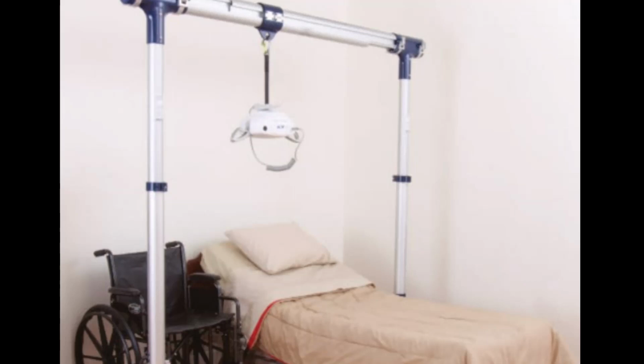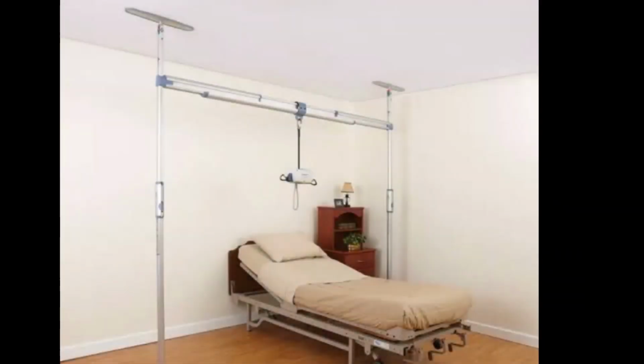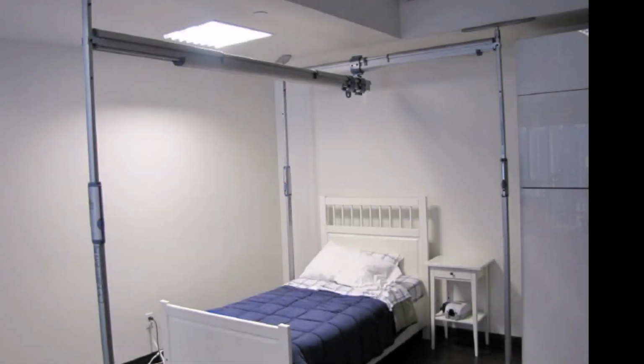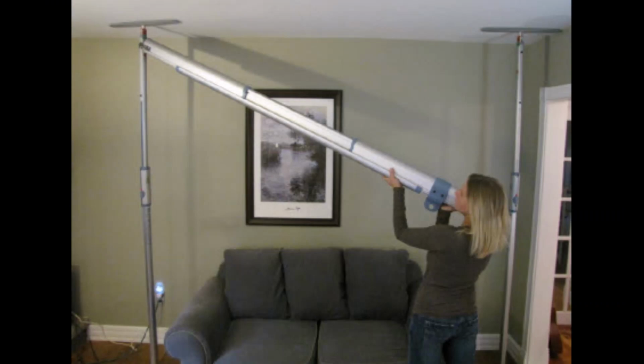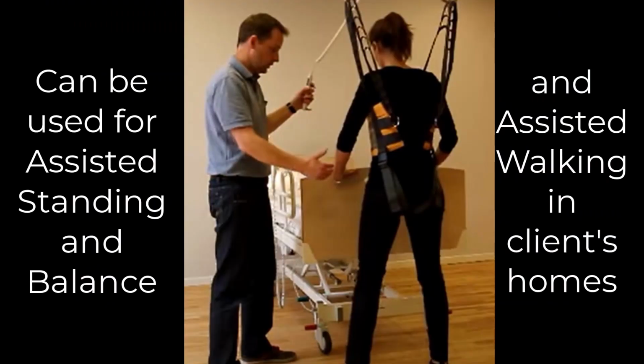These systems can be a single track supported by 2 or 3 vertical beams, or can be a boom and gantry system supported by 4 vertical beams. All these versions are available from our 2 preferred lift vendors. If you would like more information on these products, please contact your Island Health's Health, Safety and Prevention Advisor for assistance.